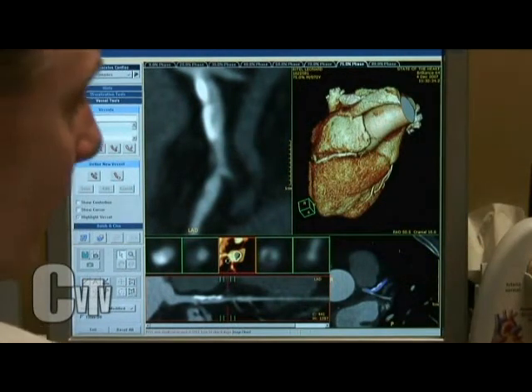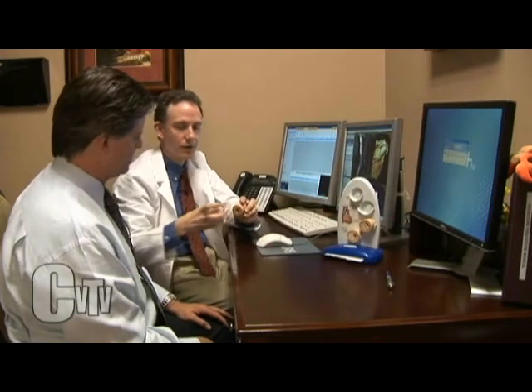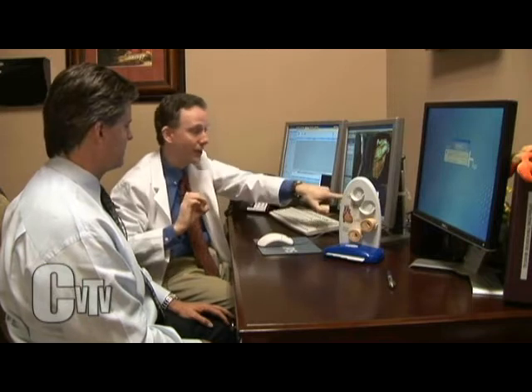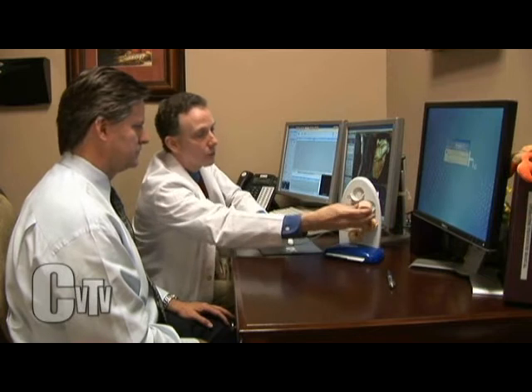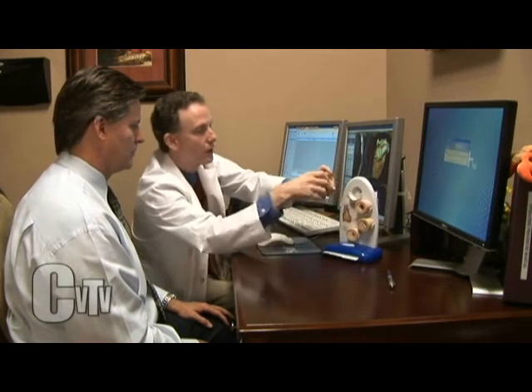So when we used to do angiograms or heart catheterizations, the limitation is, particularly because of how the plaque grows, if I did an angiogram on this blood vessel and this one, with plaque out here in the wall, and did an angiogram on that blood vessel and that blood vessel, they look the same. They're exactly the same. I couldn't tell, and I'd say they're both normal. In fact, when we used to do angiograms, I would always carefully say, because we knew that this was the case, that it is angiographically normal, which means the channels are okay, but I have no idea if you got plaque like that out here. By the time you get to here, most of the times we'll detect that on an angiogram as long as we have sufficient views.